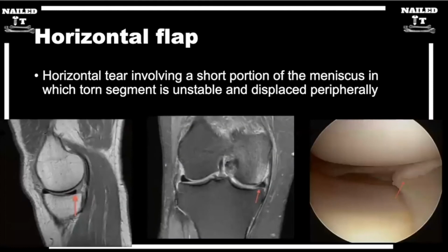Okay. And the difference between that kind of vertical flap versus these horizontal flaps on MRI, anything that you look for in particular? Again, you're going to find a propagating tear pattern from the MRI and then look and see where you're missing meniscus that you think should be there. And that's going to give you an indication of where to look for it based on where the tear pattern is. But that tear pattern will exhibit to some degree of vertical or horizontal signal in the images that you look at to give you an idea of how that tear is behaving in origin.